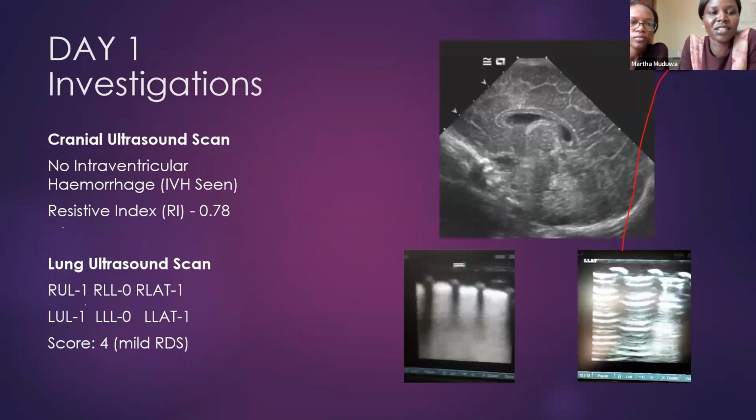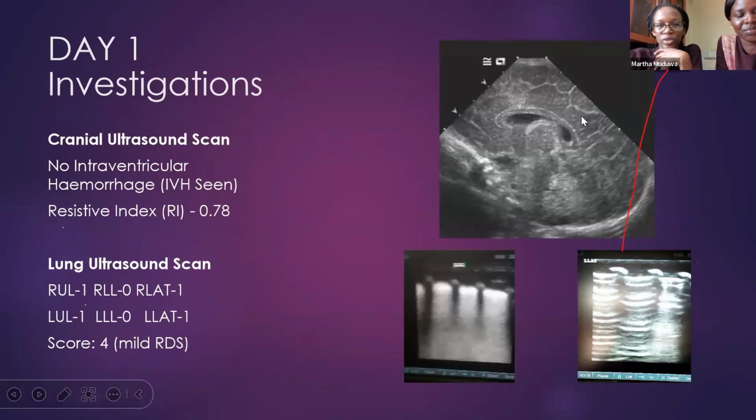Day one, the investigations were done, and Dr. Martha is going to take us through the investigations. Yes, so these were our investigations that we did. We do cranial ultrasounds on day 1 and day 7 and 28. So this is our cranial ultrasound, and it was normal. We're looking for IVH. There was no IVH seen.